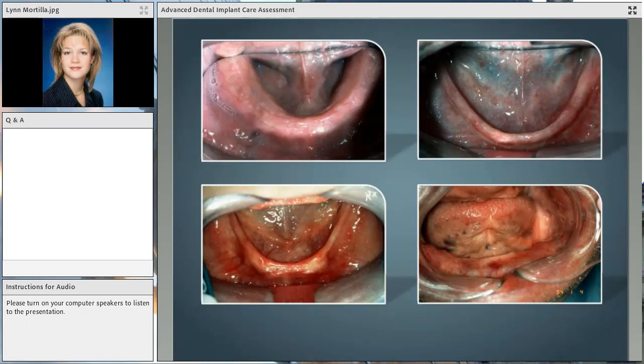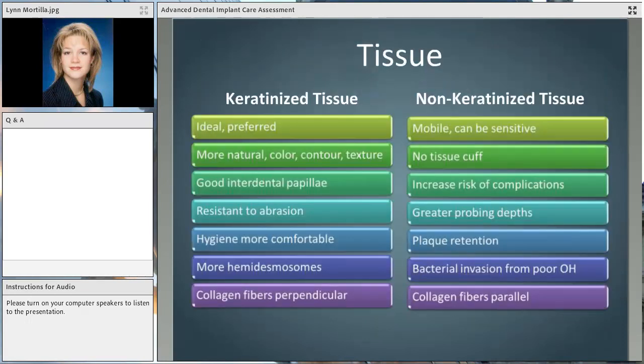It's a little bit out of the scope of what we're talking about, but I want you to be aware from an assessment phase that this is where the bone starts in the pre-treatment planning. And if there's not a lot there and we're trying to build it, it's going to take a lot of time, effort, and energy on the clinician's part, as well as there may be longer healing times and longer treatment times involved. So when we say it might not always be the fastest, this is what I'm talking about: some of these cases may take a little bit longer.